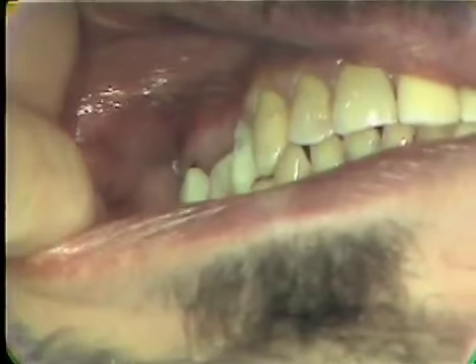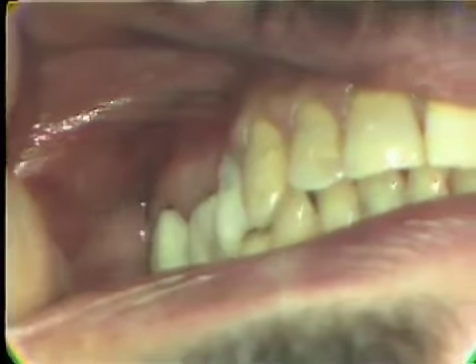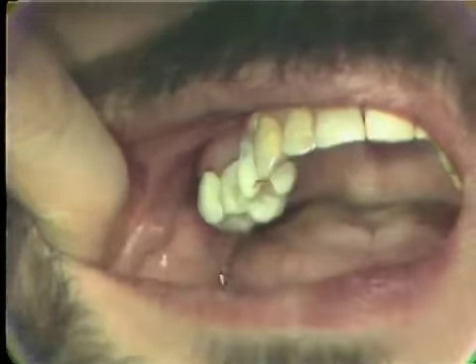Close, please. Bite hard. Does that feel like it's down? Bite hard. Open. Close again. Bite hard. Open.